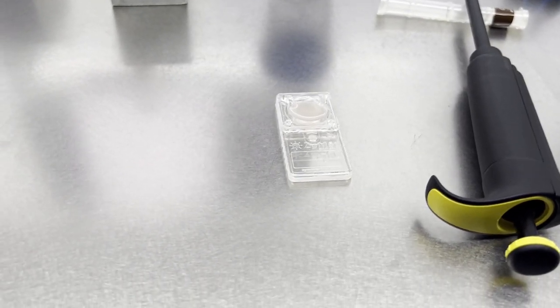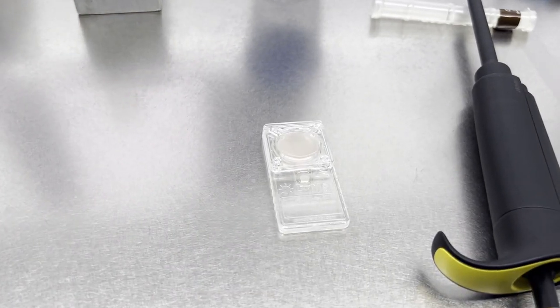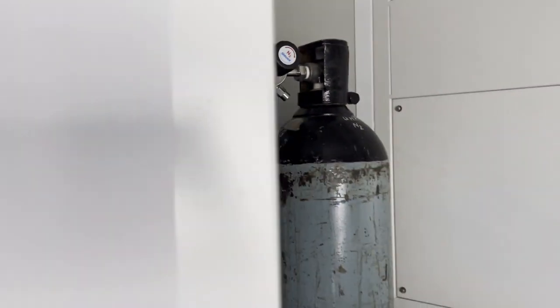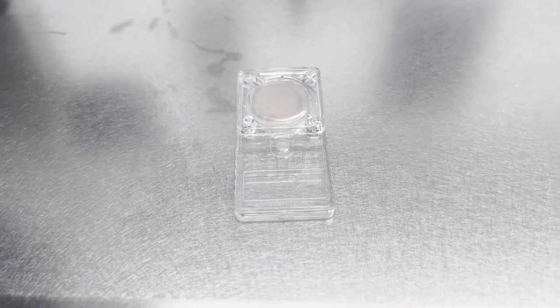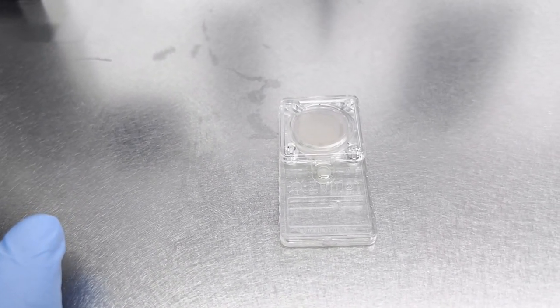After loading the semen sample and layering the sperm washing media, we are going to use the Zymot device. After 30 minutes, we are taking out our sperm sorting device. Now our sperms are separated by using this device and we are going to use that for our ICSI procedure.